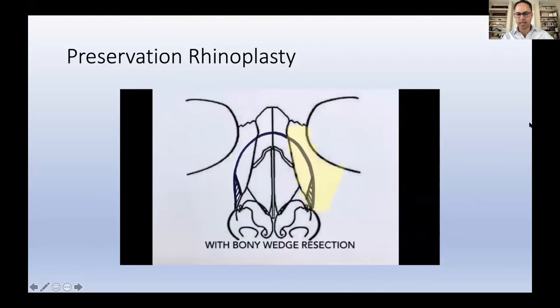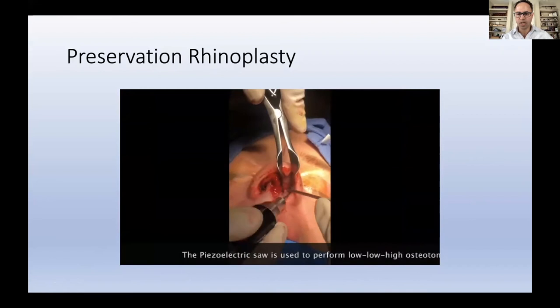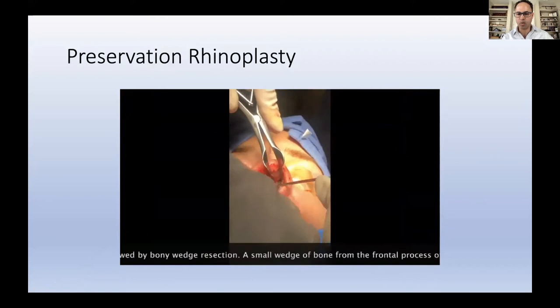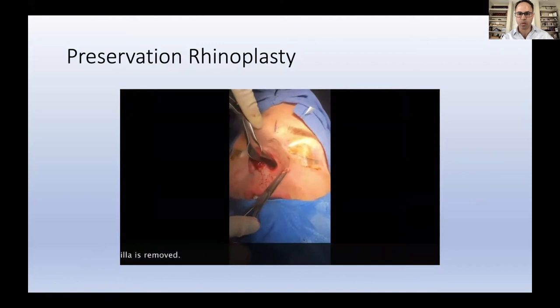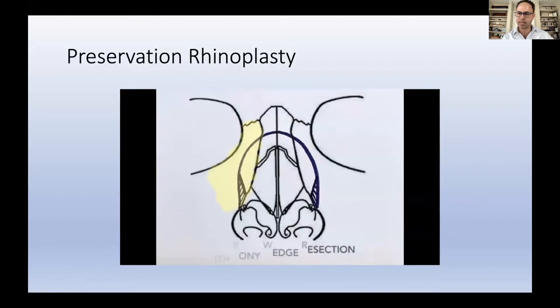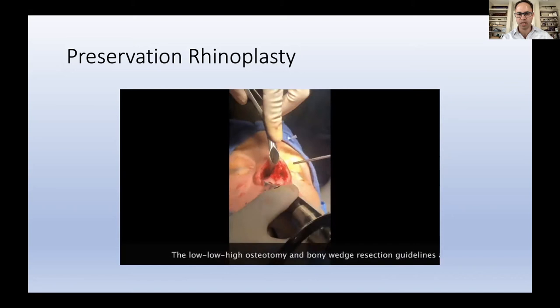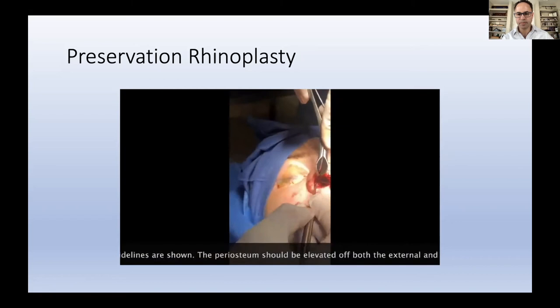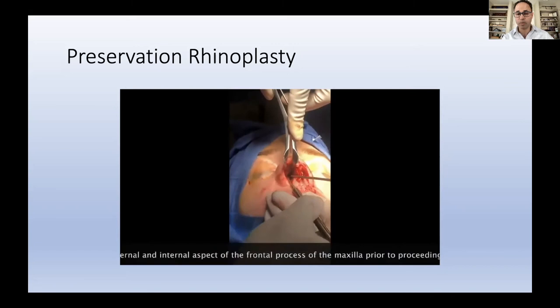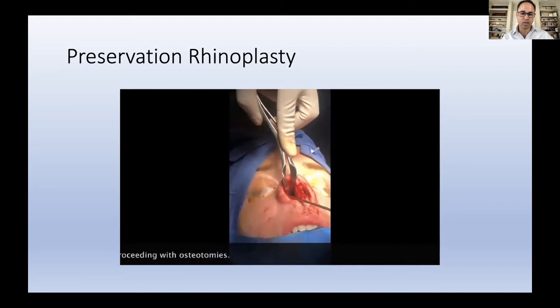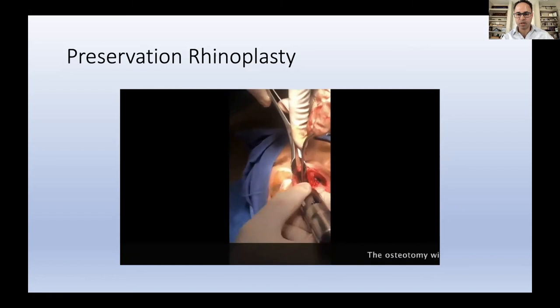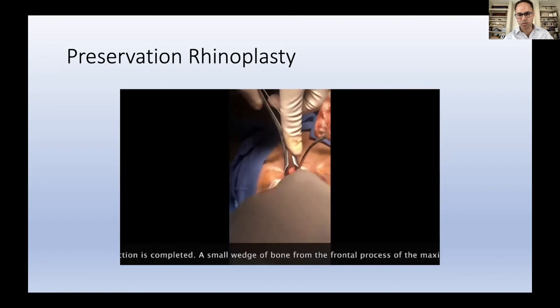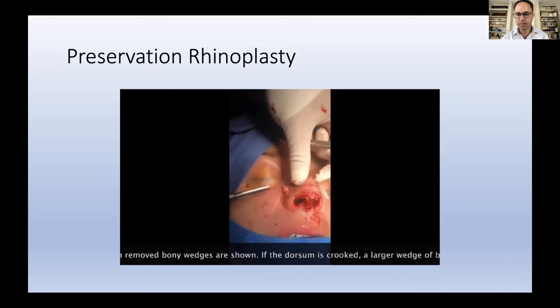This is a case we were able to record. We did utilize a low-low-high osteotomy, using a piezoelectric saw to perform our low-low-high osteotomies. We then took a wedge resection as you would for a letdown procedure. The same was performed on the right-hand side using the piezoelectric saw. You can see the demarcation of the bony wedge that was removed. We did do an open approach, elevated through a small incision superior to the inferior turbinate. The advantage of the piezoelectric saw is precision — you can use osteotomes as well to perform this procedure. There's our wedge resection on the right side.